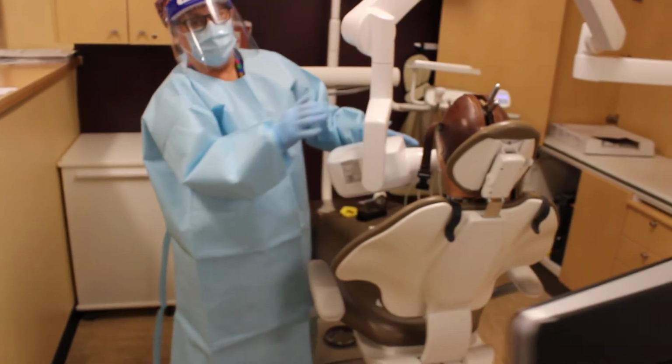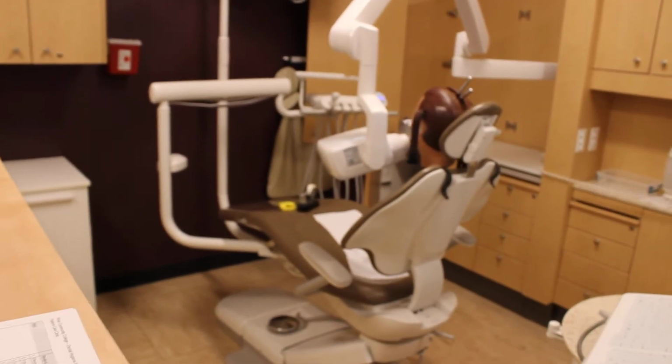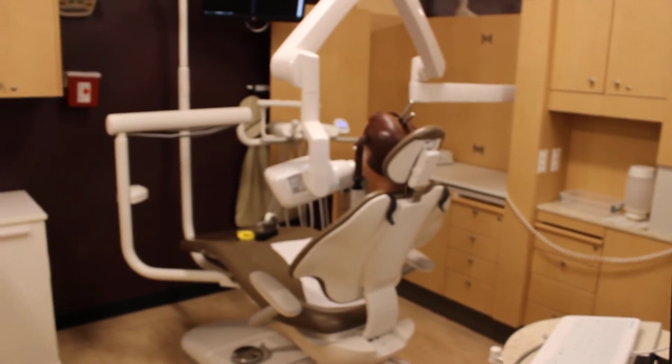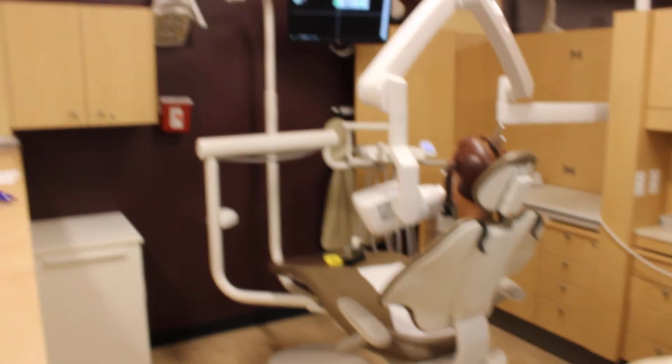And make sure this is not bouncing like it was a second ago. You want no movement. Okay, exposing. Let's see. Boom. Got it. It's gorgeous.